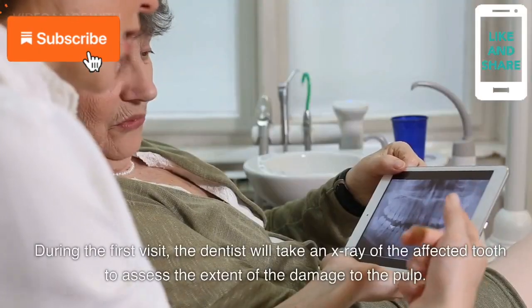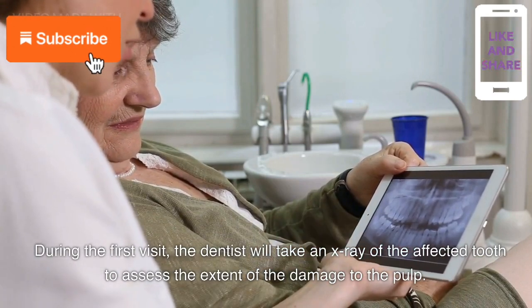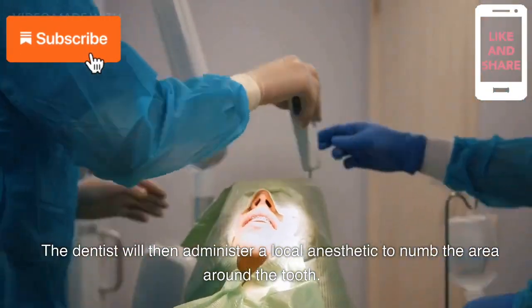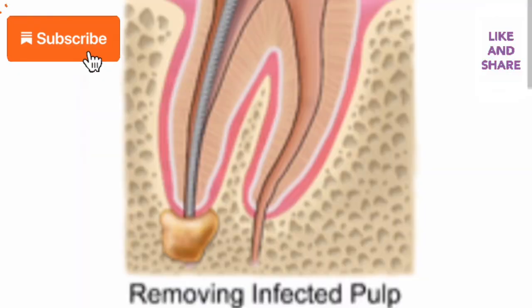During the first visit, the dentist will take an X-ray of the affected tooth to assess the extent of the damage to the pulp. The dentist will then administer a local anesthetic to numb the area around the tooth. Next, the dentist will create an opening in the top of the tooth to access the pulp chamber. Using small, specialized tools, the dentist will carefully remove the infected or inflamed pulp from the tooth. Once the pulp has been removed, the dentist will clean and shape the root canals to prepare them for filling.